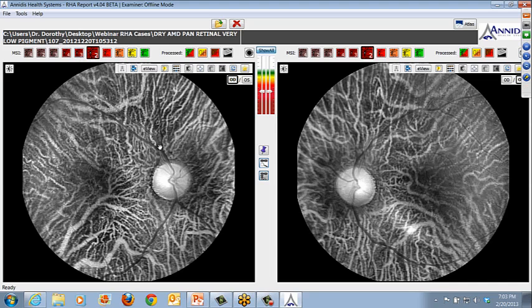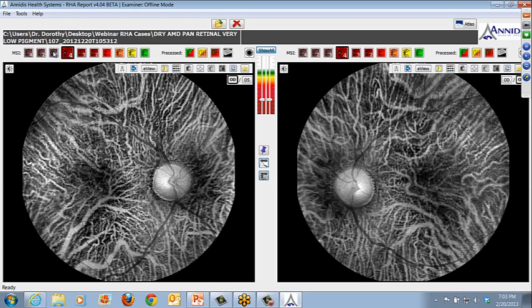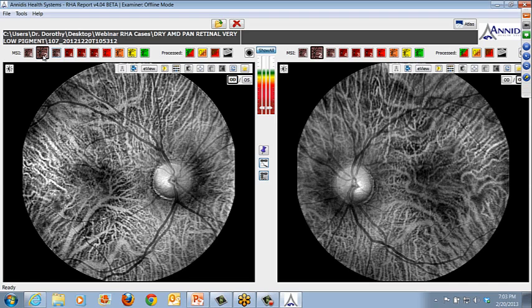And there's virtually, I don't want to say none, but there's very, very little RPE pigment reserve in the maculae. And as you go to 3 and 4 down into the choroid, you can really visualize the choroid, again, because there's not a lot of pigment blocking. You'll see a lot of Caucasian patients like this.